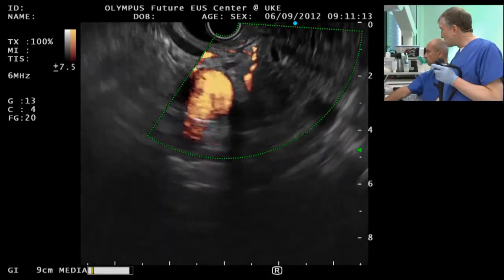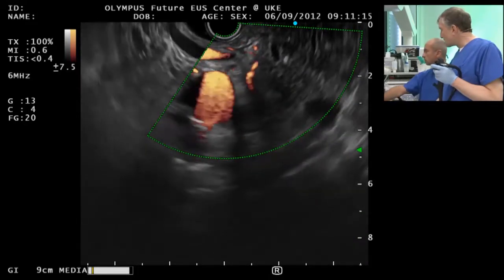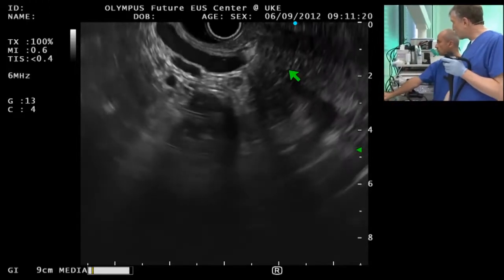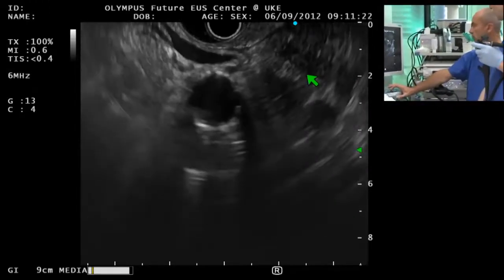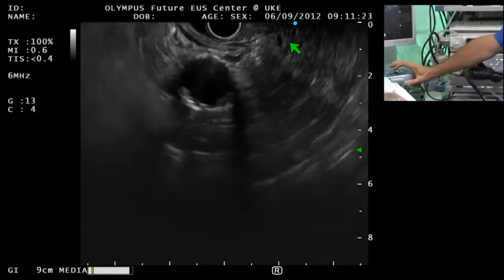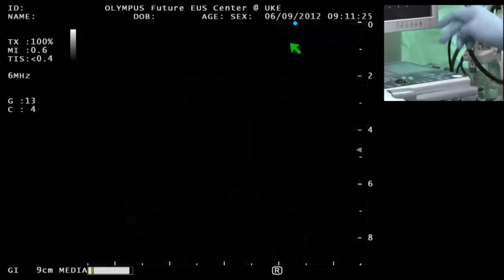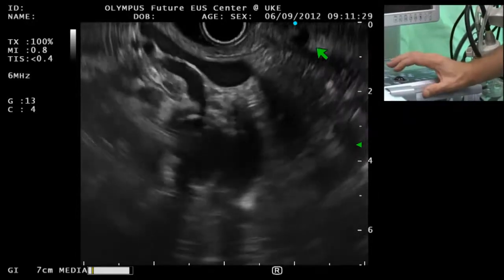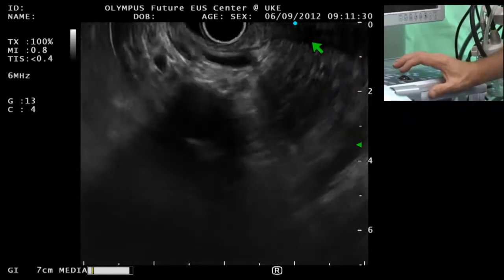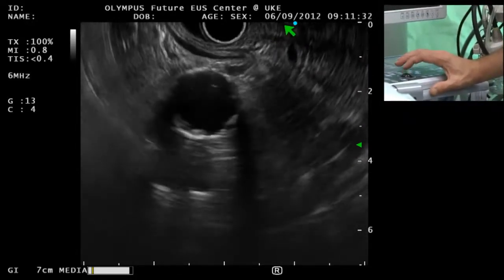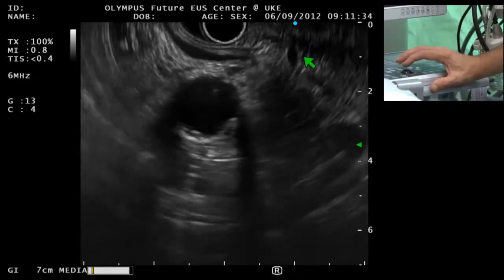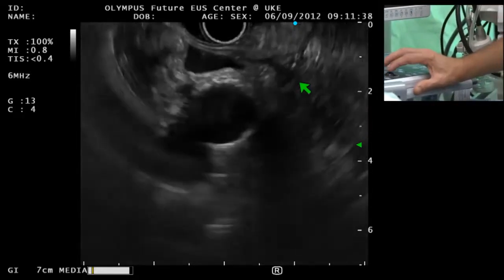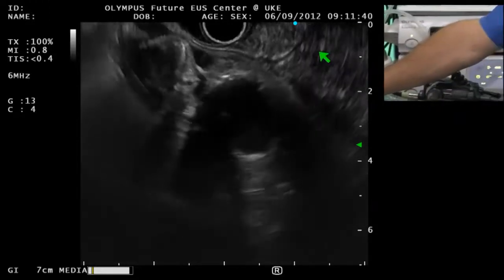Bertrand is checking whether it's not a vessel — it's not a vessel. We do the Doppler, so we follow the duct. The duct is here close to the duodenum. That's the normal part we have been filling by ERCP. So I withdraw the scope slowly.